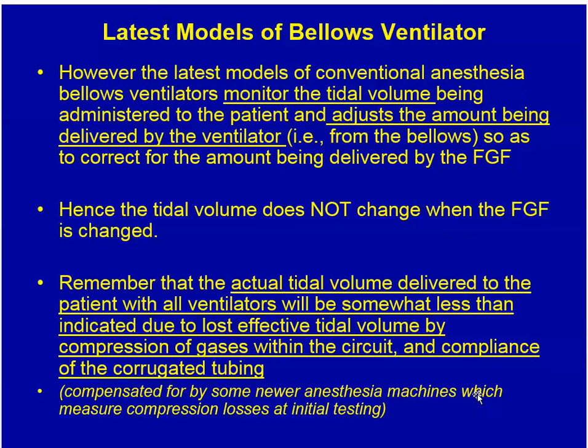As I mentioned, many of them monitor the tidal volume and adjust the amount being delivered by the ventilator to correct for the fresh gas flow. However, this takes a few breaths for the machine to figure it out. And so if you watch the tidal volume while you suddenly change the fresh gas flow, you will see that for a few breaths, if you decrease the fresh gas flow, the tidal volume will go down, and if you increase the fresh gas flow, the tidal volume will go up until the machine has time to compensate for this error.